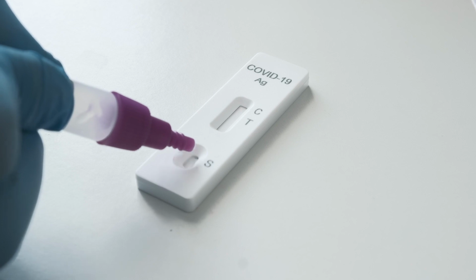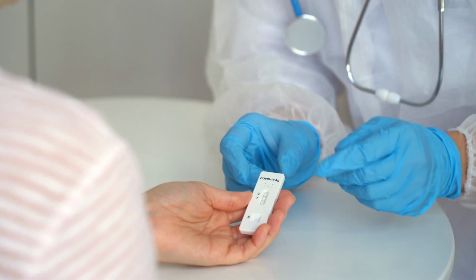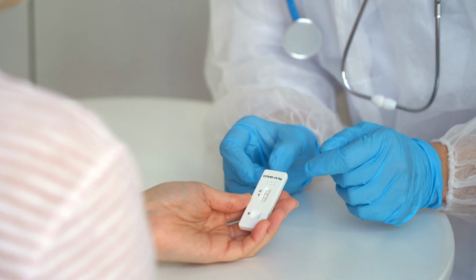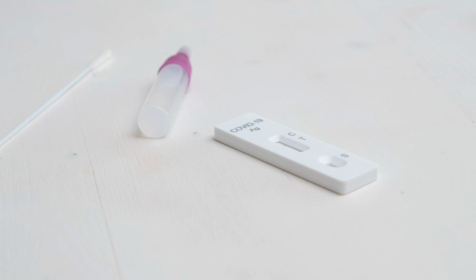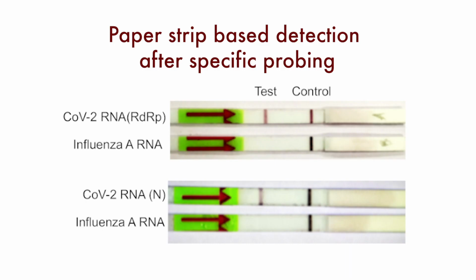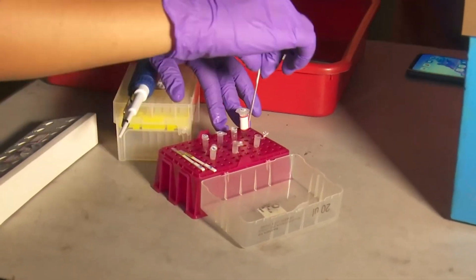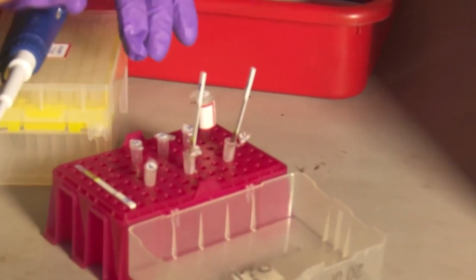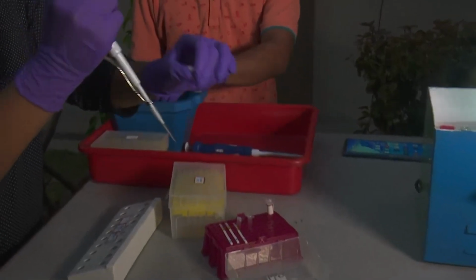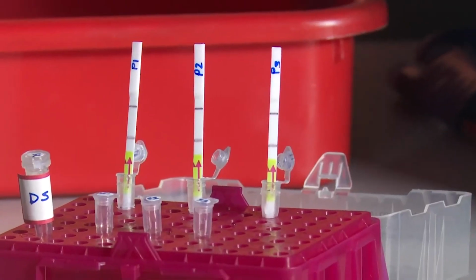On the other side, people also became aware of a very simple user-friendly test which could be conducted anywhere with very quick turnaround time, that was possible by the rapid antigen testing using a simple paper strip to get the result. We wanted to develop a test which could be almost as accurate as an RT-PCR test but could be disseminated in a decentralized manner by frontline health workers or unskilled personnel completely outside controlled lab.